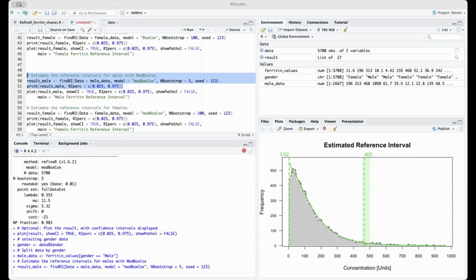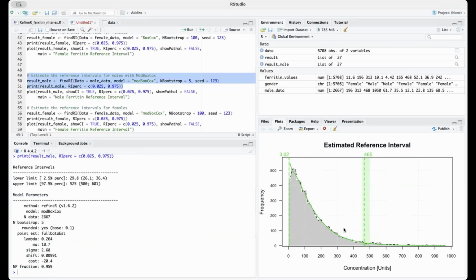It is another important thing about this estimation protocol. Here in this example, I can visually see the distribution, but you can also calculate the distance ratio for this. So, in this example, I also printed my results for reference intervals.